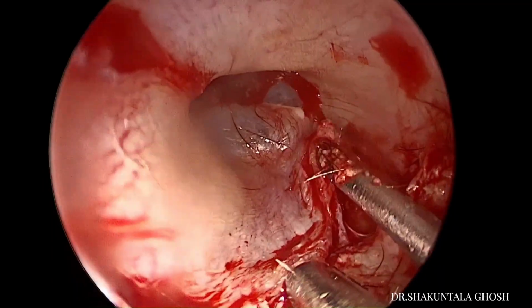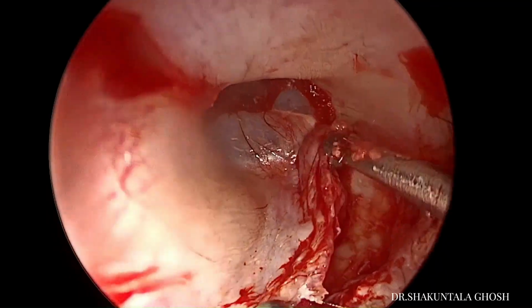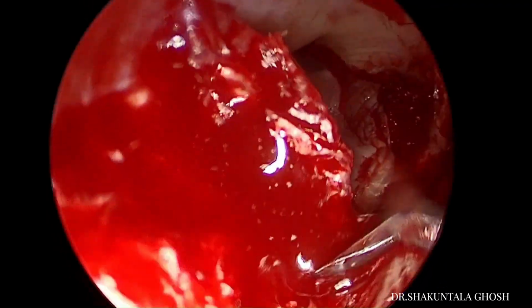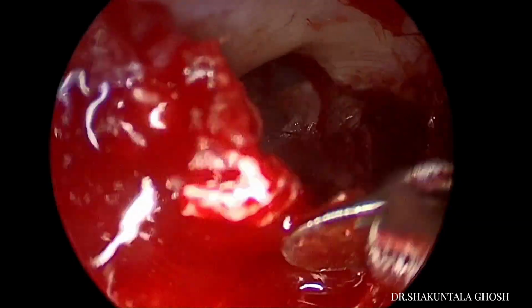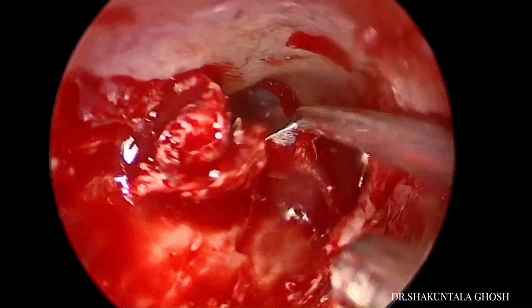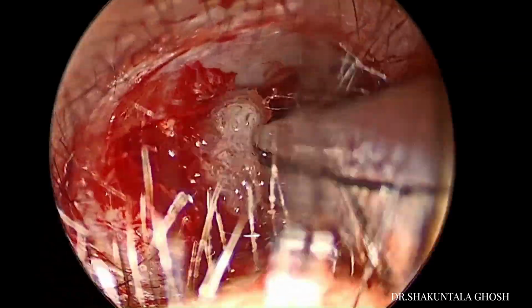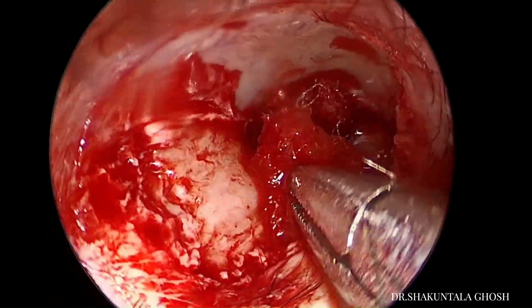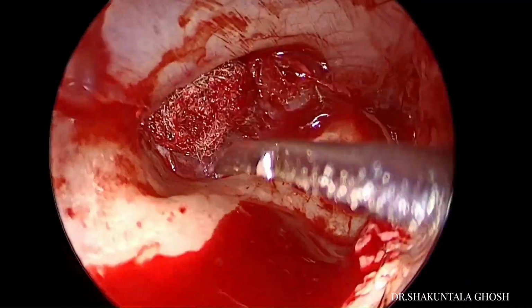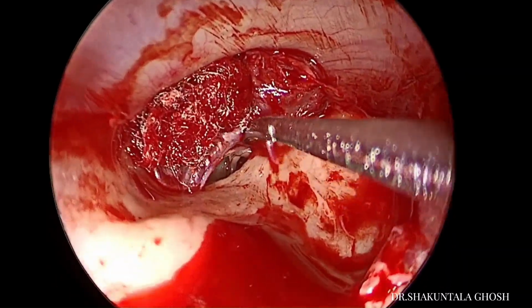So one must raise this flap in an atraumatic fashion. There should not be any tear in the flap. So gently I am raising the flap using the circular knife. And for hemostasis I am using adrenaline soaked cottonoids underneath the flap for decongestion. So this is a cottonoid placed underneath the flap because the flap tends to bleed once we are raising it, especially in the inferior part. And now I have almost reached the fibrous annulus.